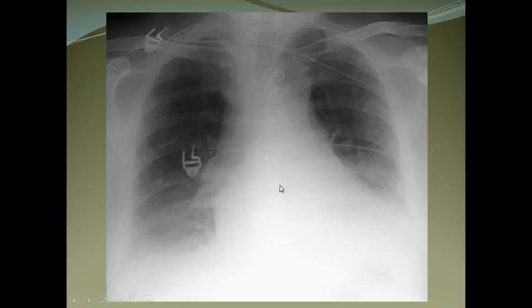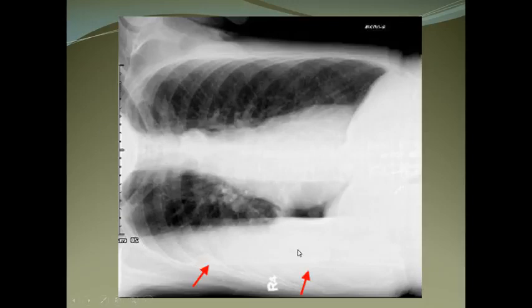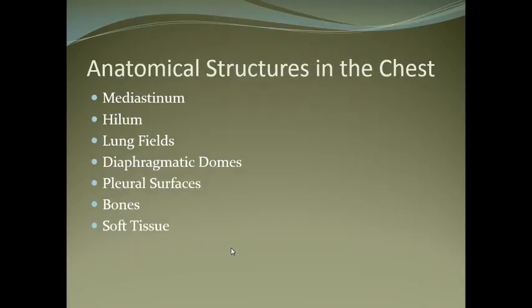On the lateral decubitus view, you can see the patient has an effusion with an air-fluid level. After resting a few minutes on the affected side, fluid appears white and the upper portion of the chest is black — because air always goes upward and water comes downward. This is the lateral decubitus film.